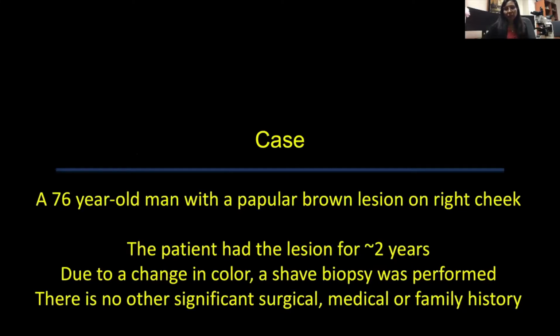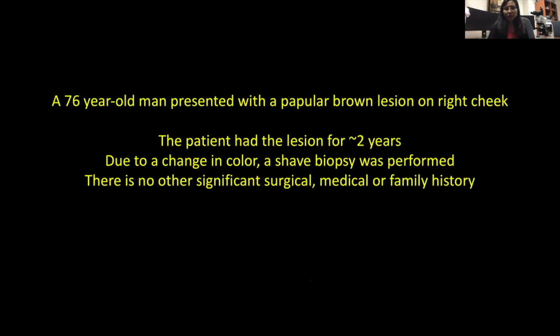Let me show you another example: a 76-year-old man with a papular brown lesion on the right cheek. The patient had the lesion for approximately 2 years. Due to the change in color, a shave biopsy was performed. There's no other significant surgical, medical, or family history in this patient. So the patient said the lesion has been there for approximately 2 years, but due to the change in color, a shave biopsy was performed.